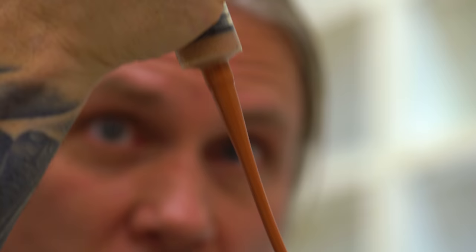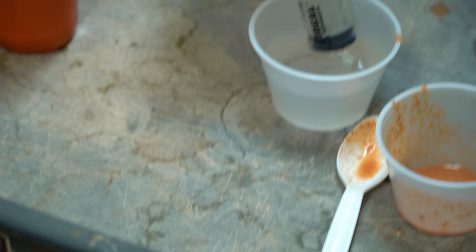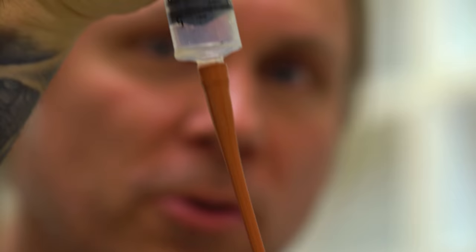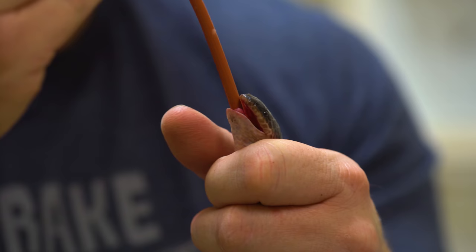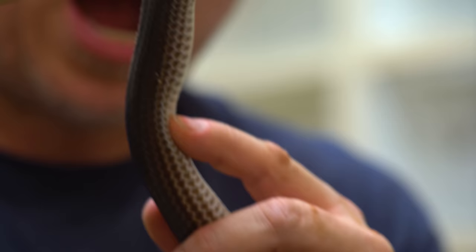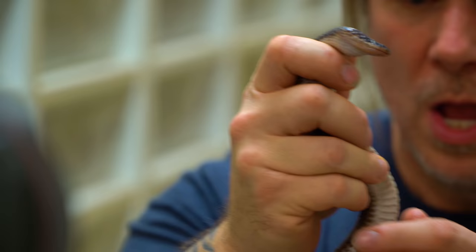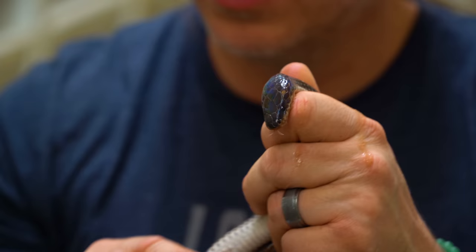I'm going to hold the snake up and very slowly tube all of that stuff in. Now some of that mixture is going to be in the actual catheter, so I'm going to suck up probably two or three cc's of water and push that back through the catheter — not only will it clear out all that solution, but it'll give it a little more hydration. Oftentimes when a snake starts to regurgitate, it actually is a dehydration issue, not to mention it's not getting hydration from the actual prey. Now I'm going to slowly remove this.